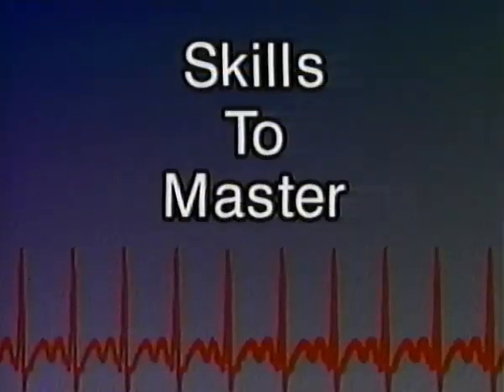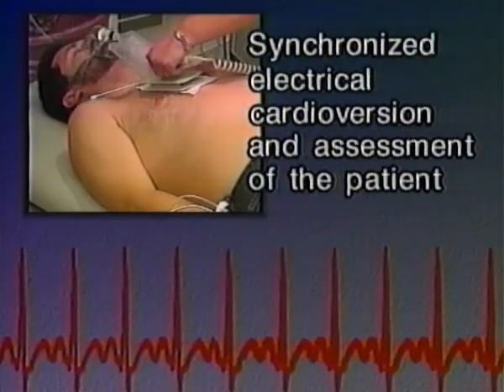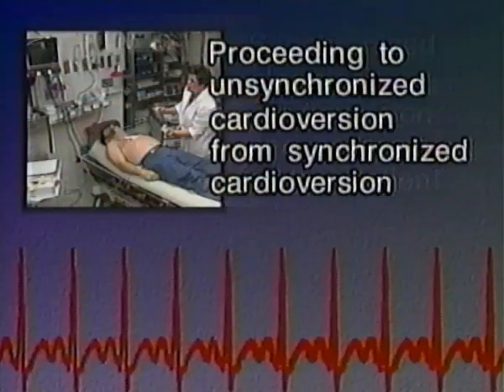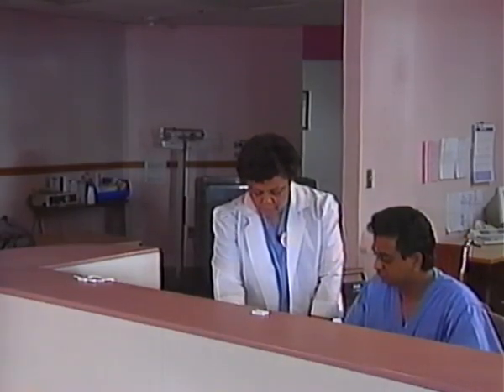Skills needed for successful performance in this scenario include assessment of unstable tachyarrhythmias and diagnosis of rhythm, synchronized electrical cardioversion and assessment of the patient, and proceeding to unsynchronized cardioversion from synchronized electrical cardioversion. We will now see an emergency situation involving a patient who experiences unstable tachycardia.